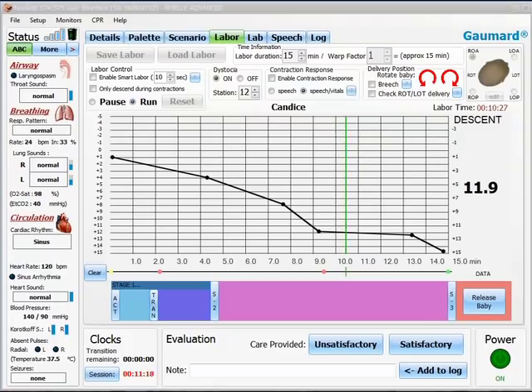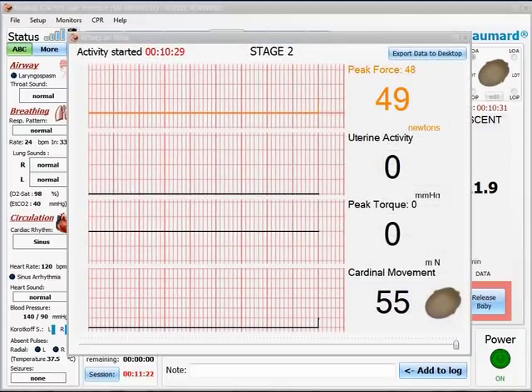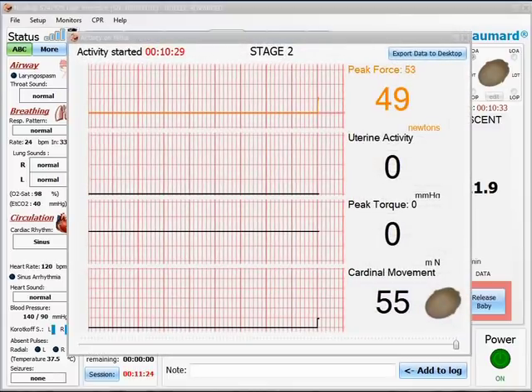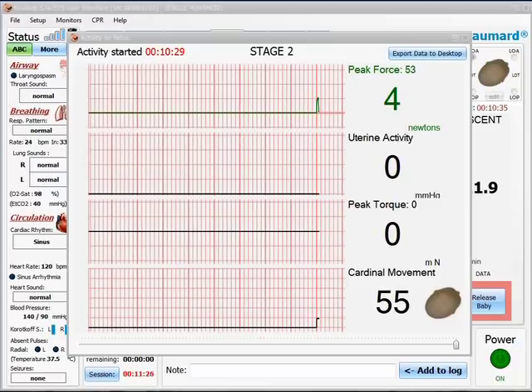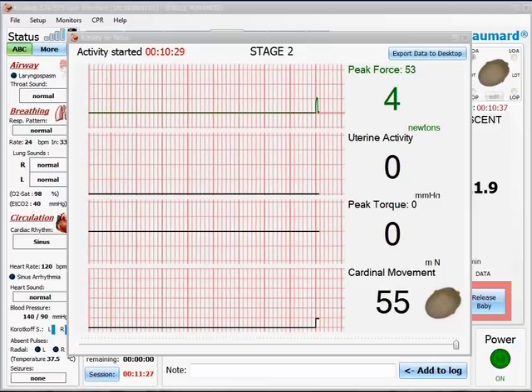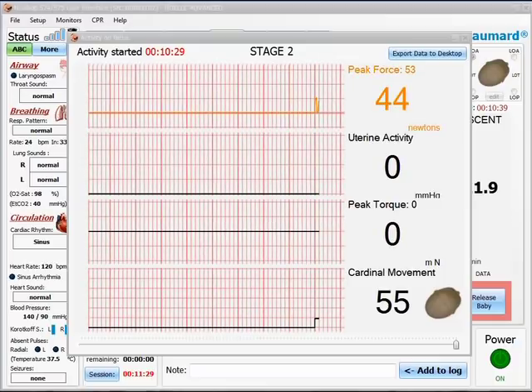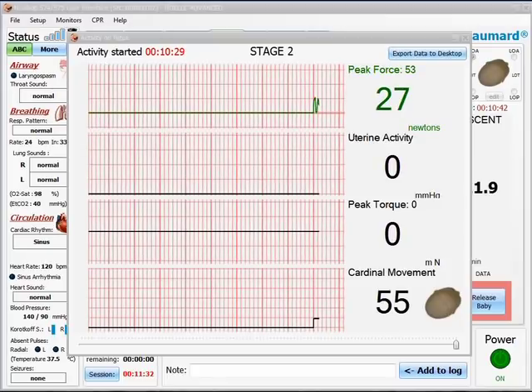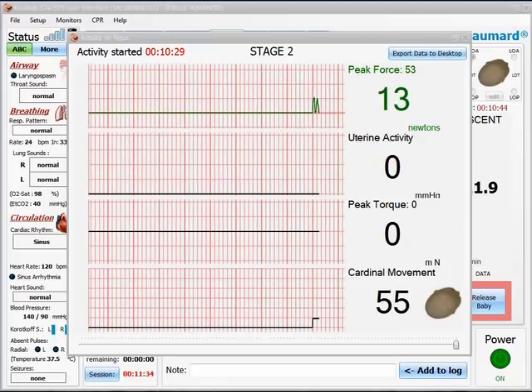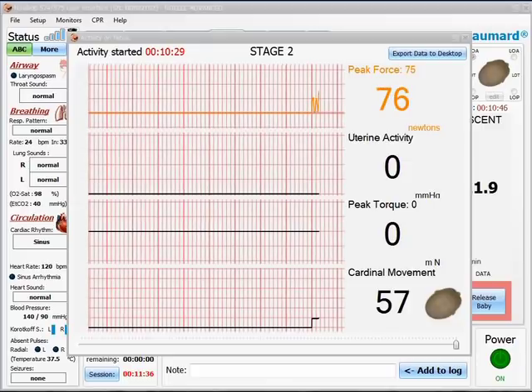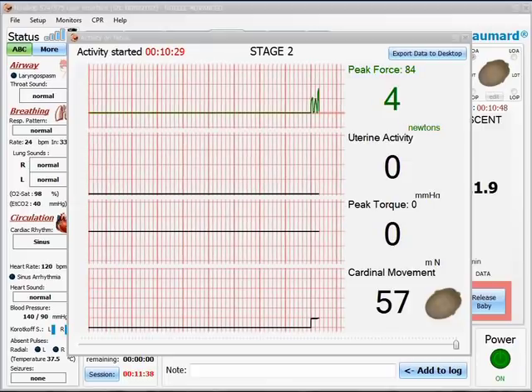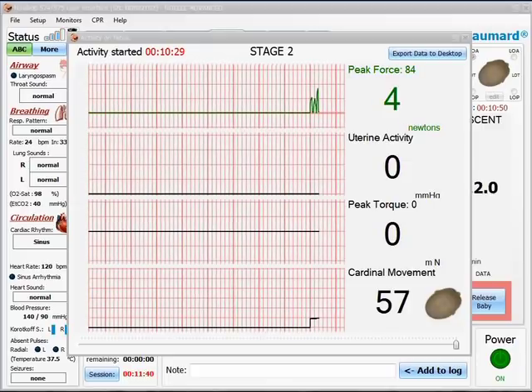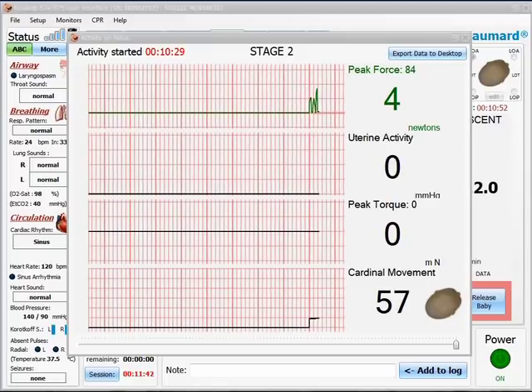When the force window appears upon the screen, you will notice that the force readings appear green, yellow or red. The green color means that the force is within the nominal range. Yellow means you are in danger of possibly causing an injury to the child. And red means you are highly likely to cause damage to the child.